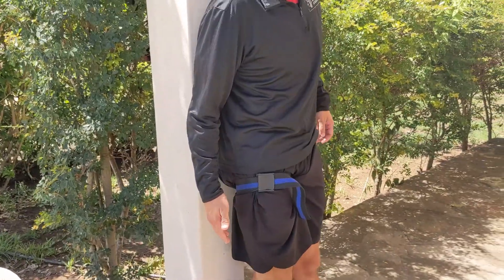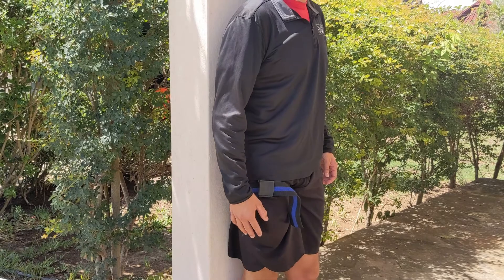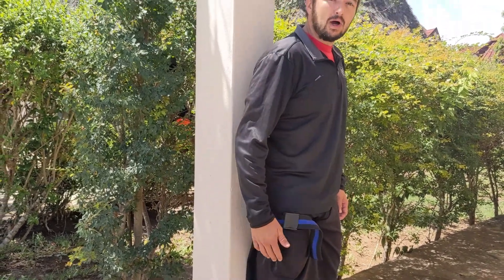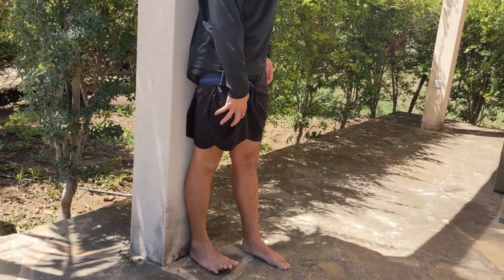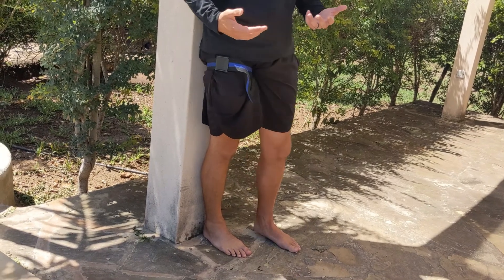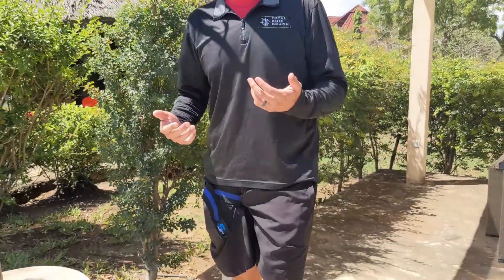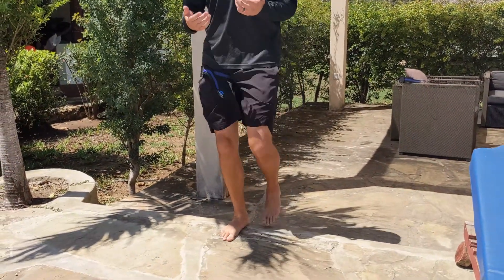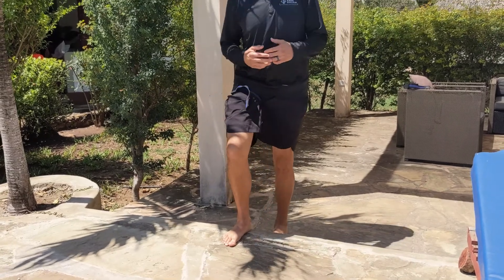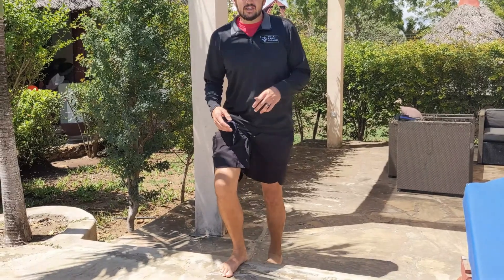When doing these blood flow restriction exercises, I'm working my quad, and in a meaningful way straightening my knee all the way, making my muscle learn how to control that while putting weight on my leg. We can make this harder by squeezing back and trying to lift the toes — that automatically makes the quadriceps squeeze a little harder. As I'm getting up on 30 reps, I can feel a good muscle burn in my quad, making my muscle stronger without a lot of resistance. I'm not having to breathe hard or work that hard. After doing 30, I rest about 30 seconds, then cycle through and also do 30 step-ups — a really functional exercise that's not hard, and you can start with a really small step. With a blood flow restriction cuff on, the goal is for exercises to be pretty easy, allow you to exercise without pain in your joint, and get some muscle burn going.